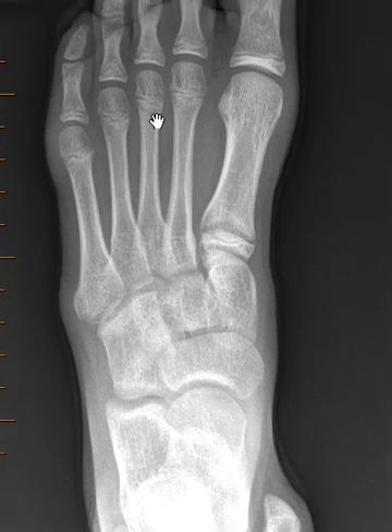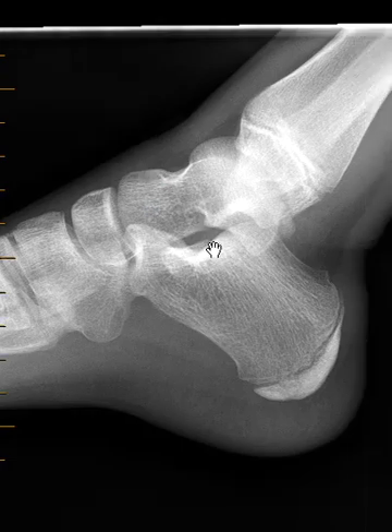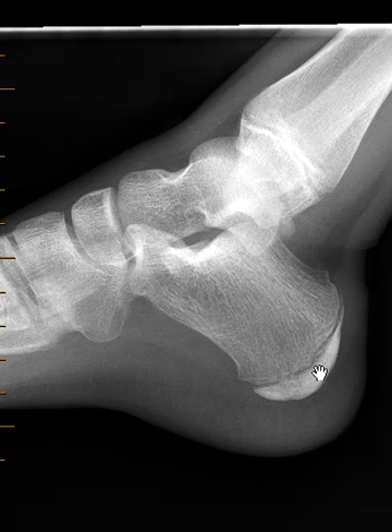Her metatarsal bones look good, her tarsal bones look within normal limits. This is the back of the foot — the talus and calcaneus — they look good. The lateral view, the side view, looks good as well. This is the calcaneus, and down here is a growth plate called an apophysis.